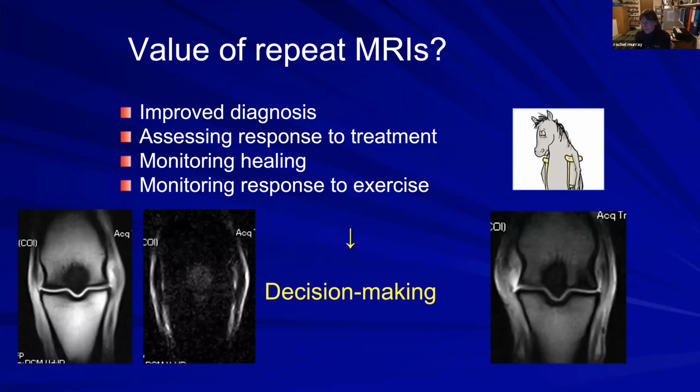So it depends on what the specific injury is, and it might be a penetrating injury to the foot. We need to know what's happening with that, because sometimes the clinical picture does not reflect what's actually going on, or the clinical picture is fine, and then after, day 51 it's sound, and then day 52 the leg falls off, which sometimes does happen. And I think that if you had MRI'd it somewhere in that process, you might have known that things were about to break through a structure and you need to do something more drastic.